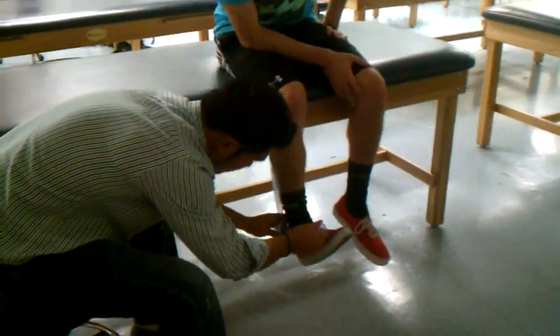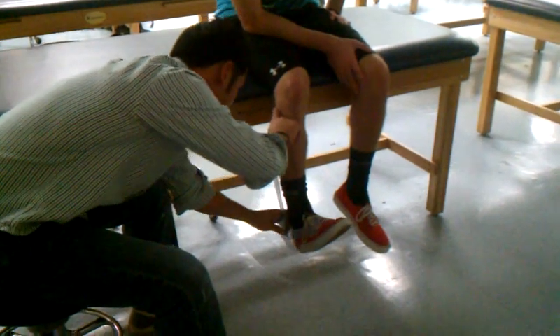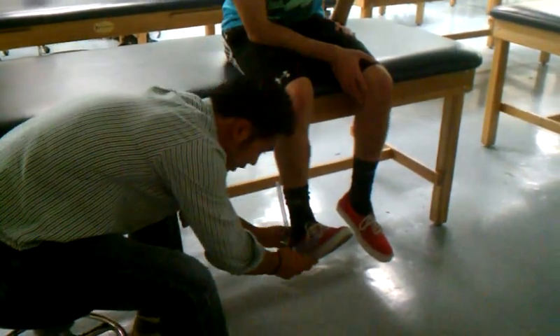When he goes into dorsiflexion, the moving arm is parallel because I'm lined up with the axis here. Starting at zero and going into dorsiflexion, he had about 20-something degrees. What's normal? 20 dorsiflexion, 50 plantarflexion.